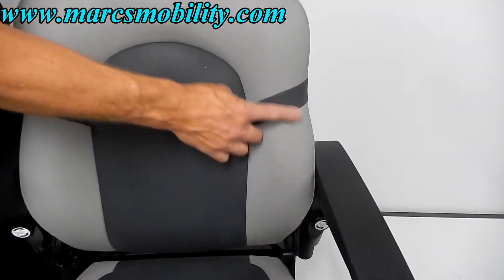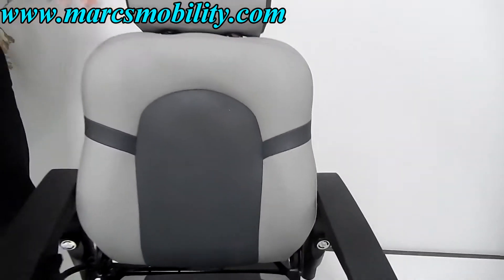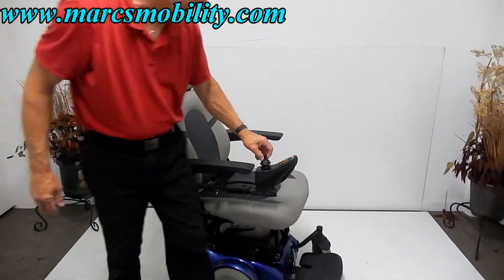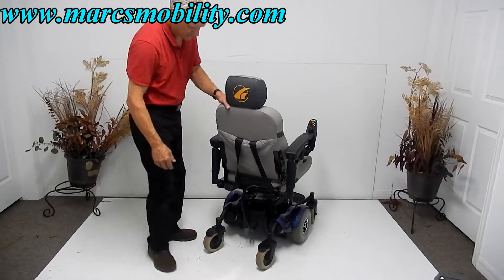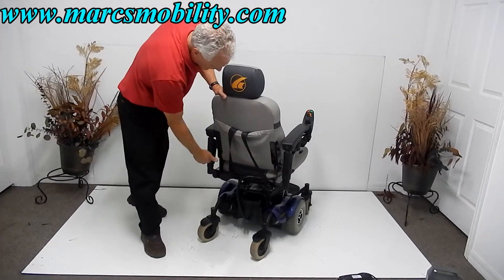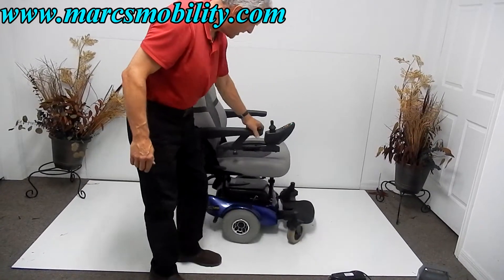The only thing I've noticed about this chair is there are a few cat scratches, which will not bother the chair and will not get any worse. Sometimes these chairs sit in people's homes for a while before they're sold and cats do their damage. I'm not going to fix that because it's hardly visible. It does have a safety belt stored in the pouch in the back.